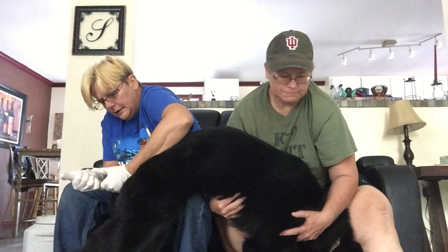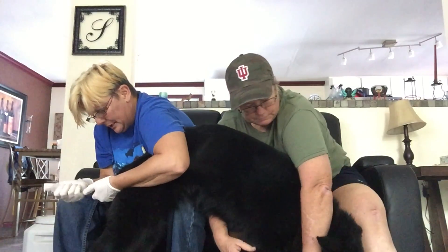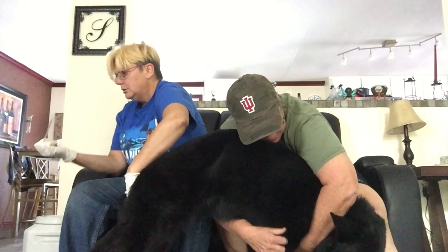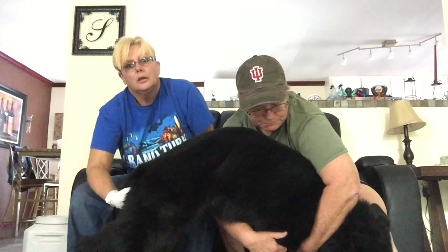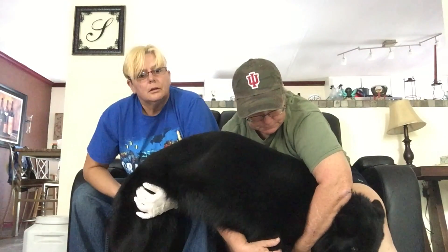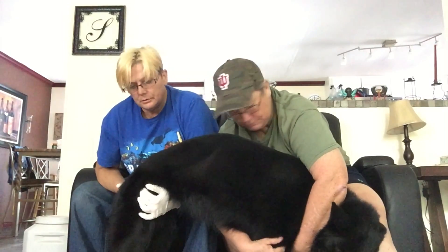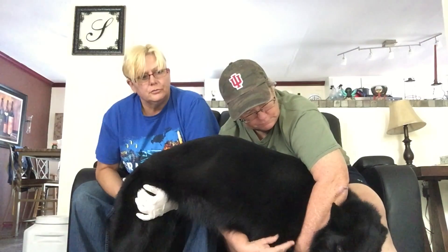I'm going to squeeze number two, and then I'm going to push some air behind that to push it in further to make sure. Then I'm going to massage — feathering her vulva. And why do you massage? This helps her contract, and it makes her contract for the semen to suck inside there, a little closer to her uterus, to make sure she actually takes. It simulates the tie for her as well. I feel her pulsating — that's exactly what you want, that pulse.